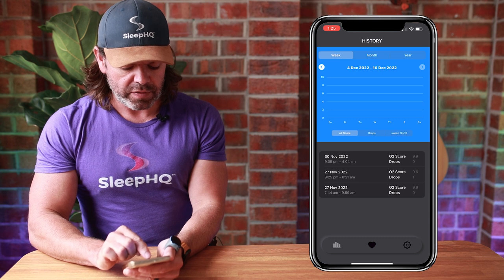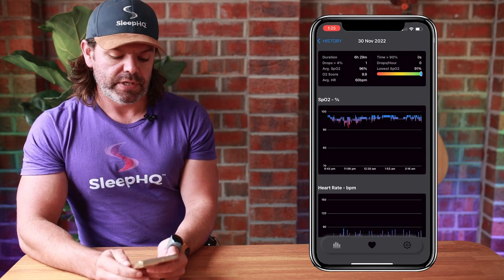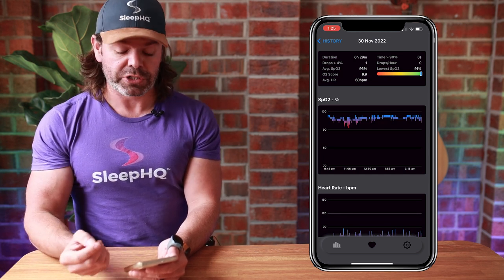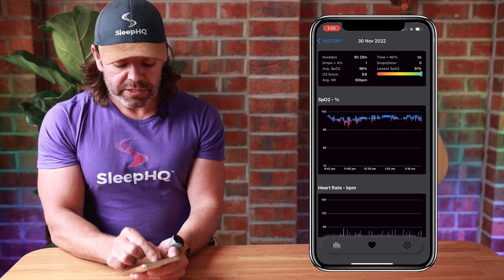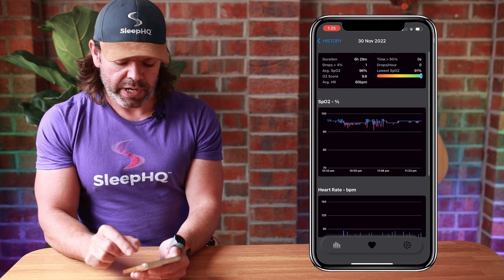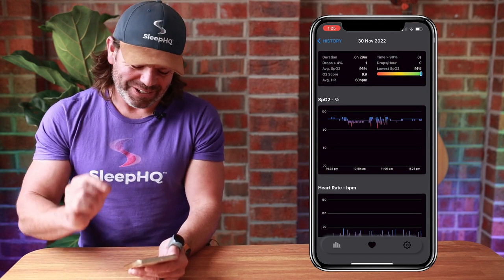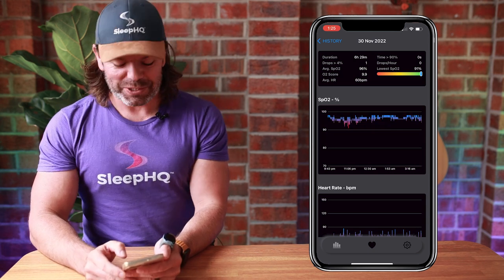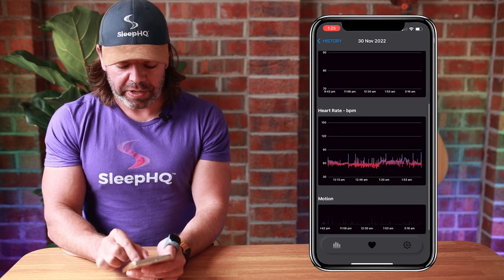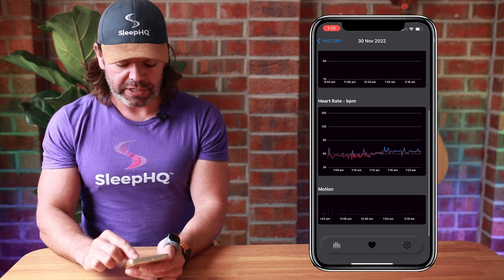Let's look at the 30th of November. At the top we have some statistics, then we have our SPO2, which is our blood oxygen levels. If I pinch and zoom on the graph, I can zoom in to an area that's not looking too good — room for improvement, that's what I always say. We can scroll down to look at heart rate, and we've also got our motion data there.